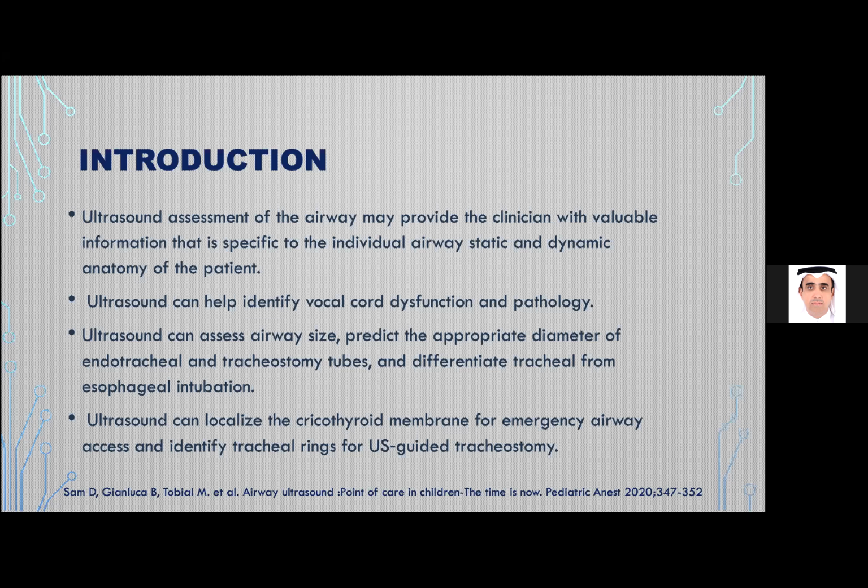For scanning, when you start the examination, you should go for both approaches, transverse and longitudinal views. You have to keep the patient in the supine position, in the sniffing position, with the head slightly flexed to make it easy for you to scan the patient.